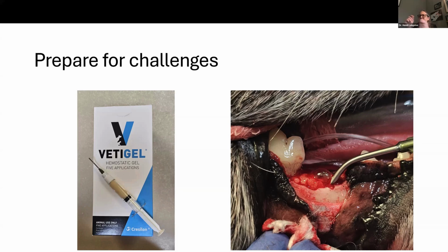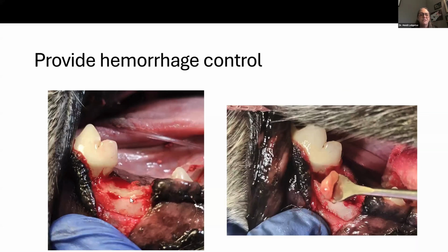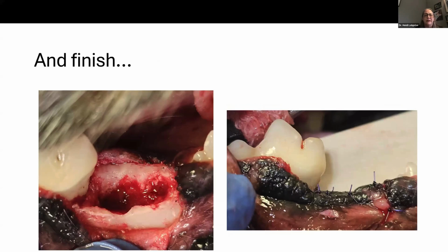And then I had a little something else to do somewhere else. Came back. The gel was in here, just a little bit of oozing. I was then able to remove this. Now, if I didn't have a root in there, I would have just sutured up, okay? But since I did have a little bit more work to do, I went ahead and removed it quite easily. I was able to access that root, get it out. You can see how much cleaner it is. Finish cleaning that tooth. I smoothed off that bone.